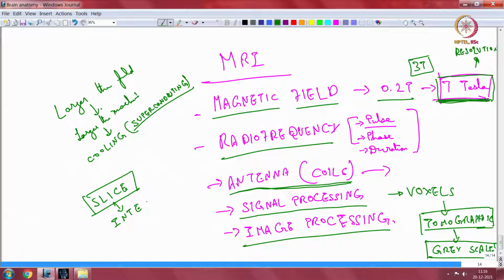How do you bridge the gap between the slices? How do you interpolate data? I think that's the correct term. There are gaps, and you need to do interpolation to accommodate for the data between the 2 slices. And the thicker the slice, obviously the lower the resolution.